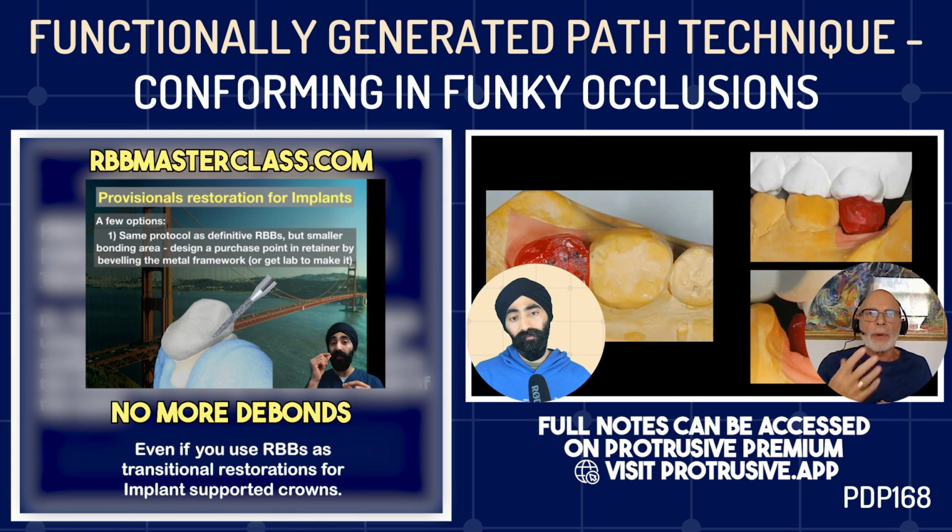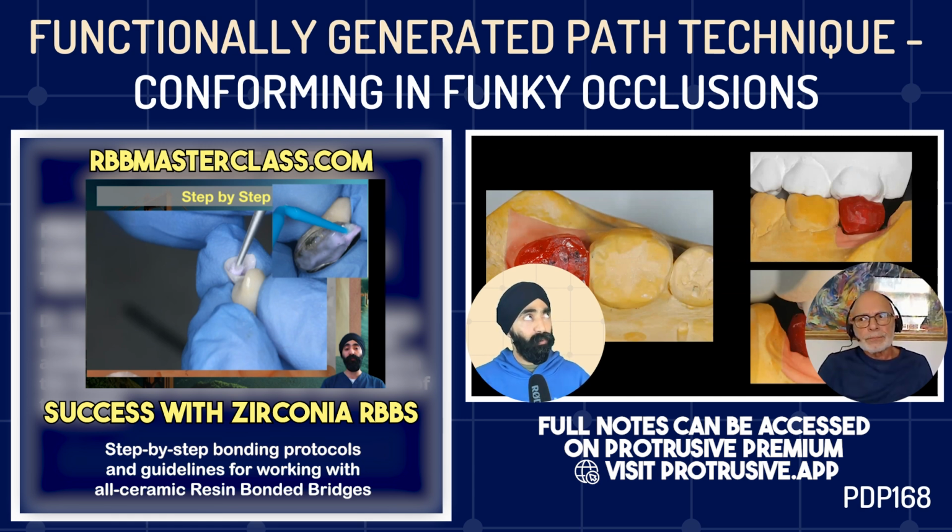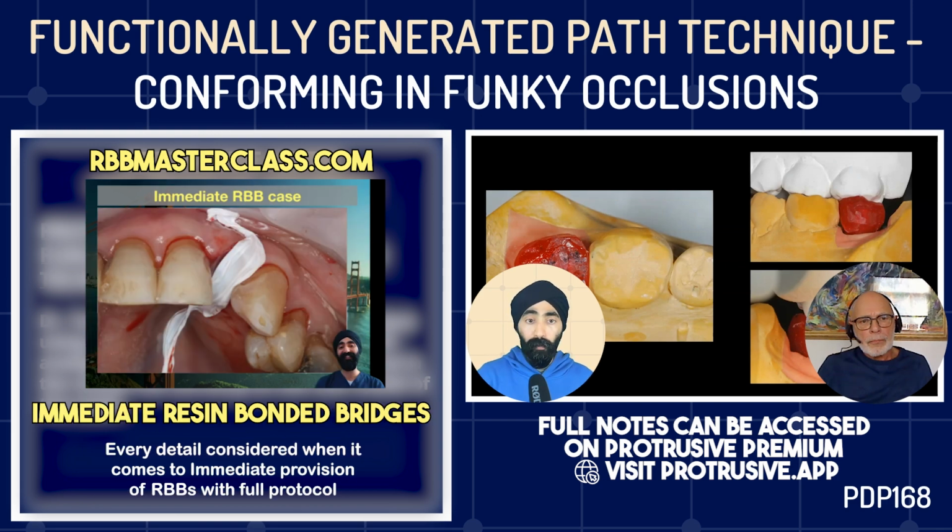Mm-hmm. You're bypassing that, but I think there's fractionally more room for error in that your little composite hat doesn't fit the model as well as my Duralay hat, which was made on the model. I've never actually done it on models. I've always done it digitally, but as many of us are going digital, here's something for people to remember from our chat today about this technique, and they can probably use it if they've got a scanner. It particularly lends itself to a pre-prep scan.